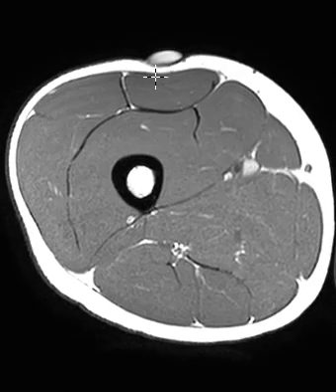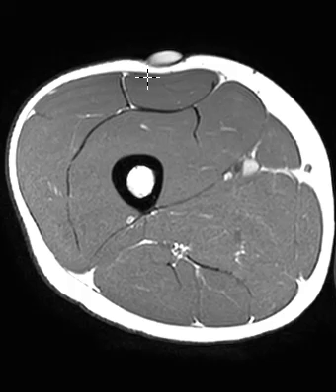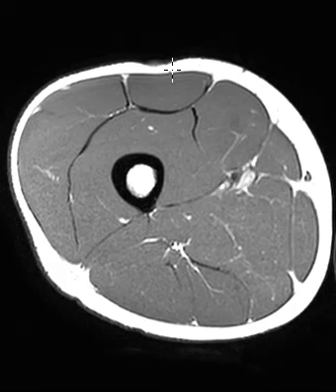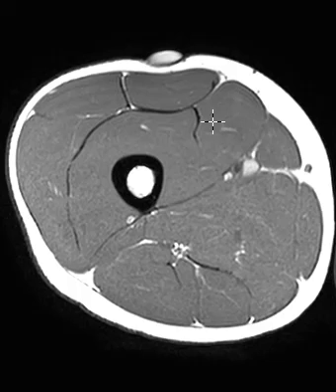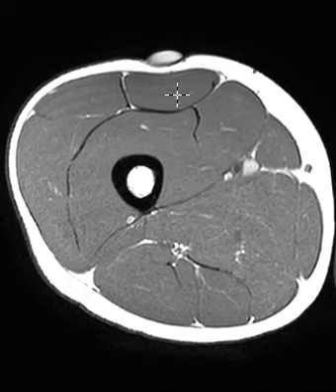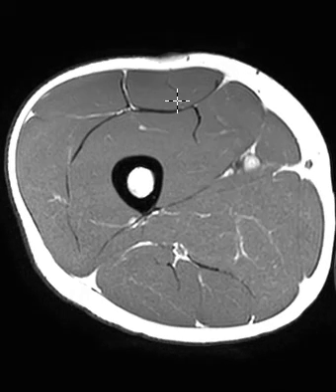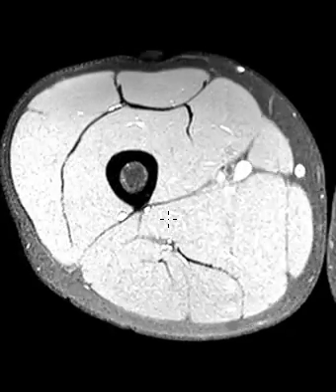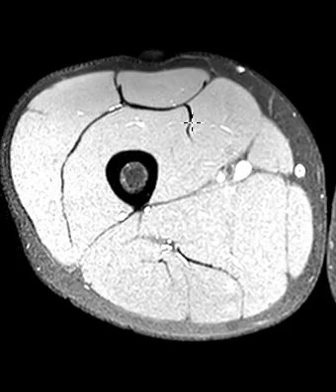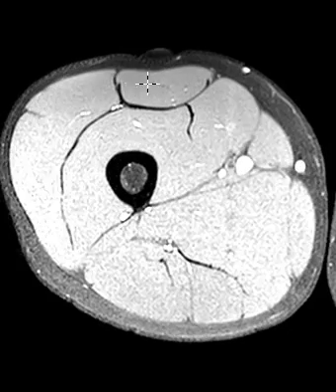This is the mid-to-distal aspect of the thigh, and this is the rectus femoris right here, so it's right in the distal rectus femoris. This is the vastus lateralis, medialis, intermedius here. On this T1 image that's not fat-suppressed, things are completely normal. Here's the fat-suppressed T1 sequence, which also looks completely normal.